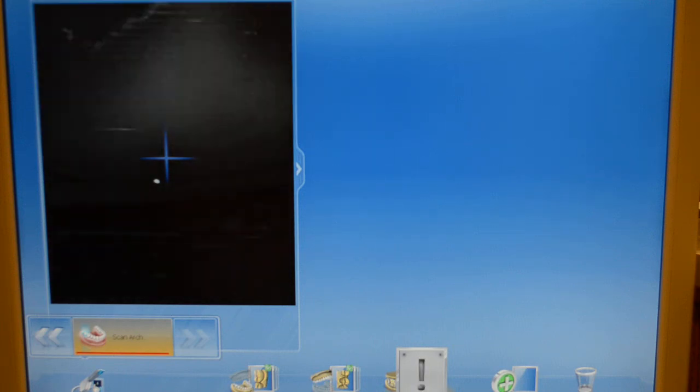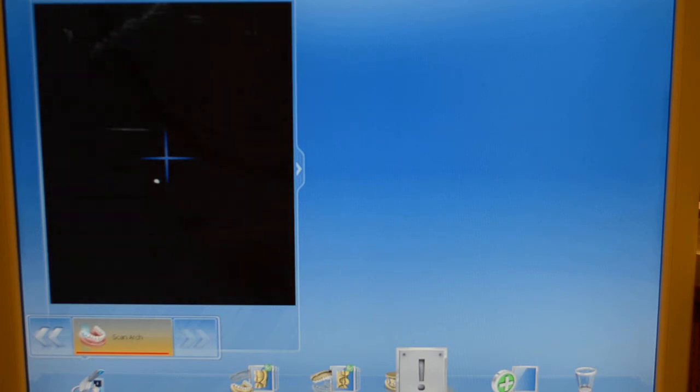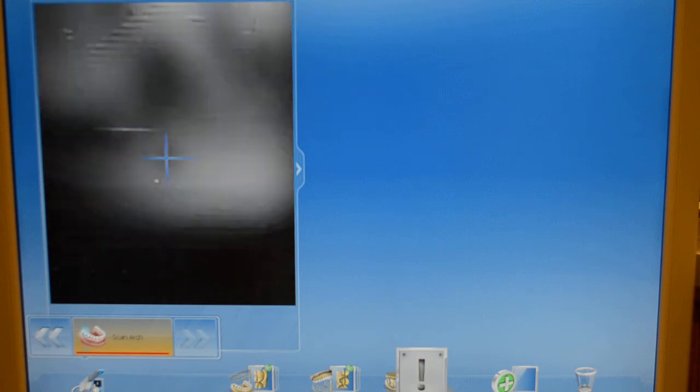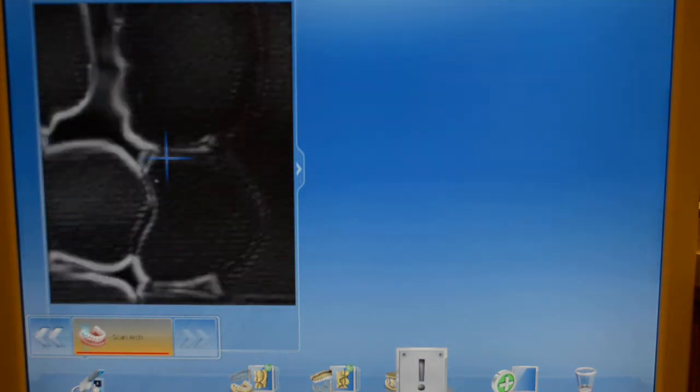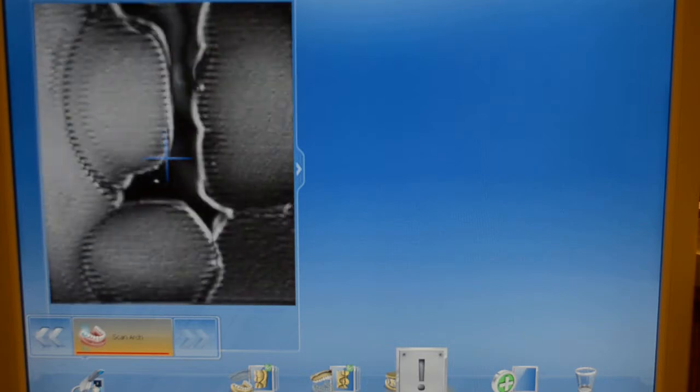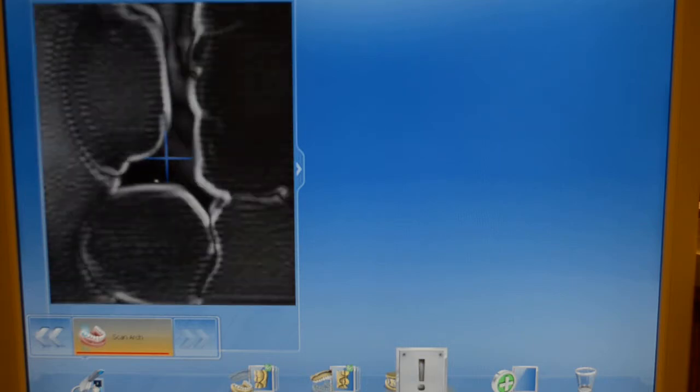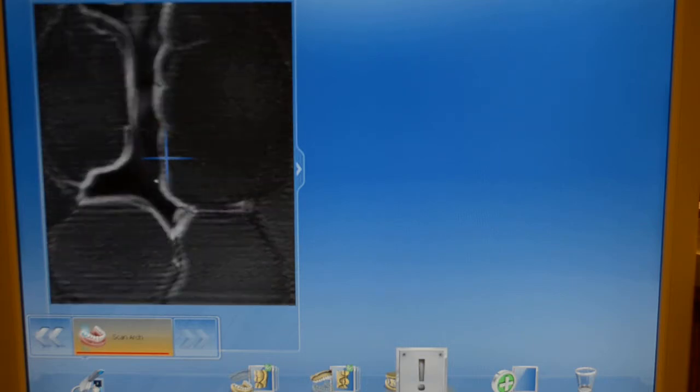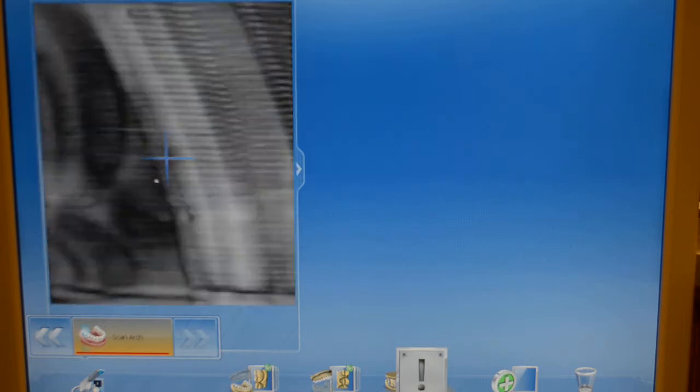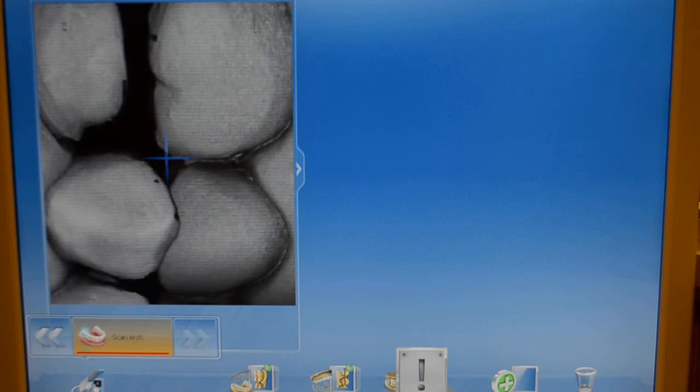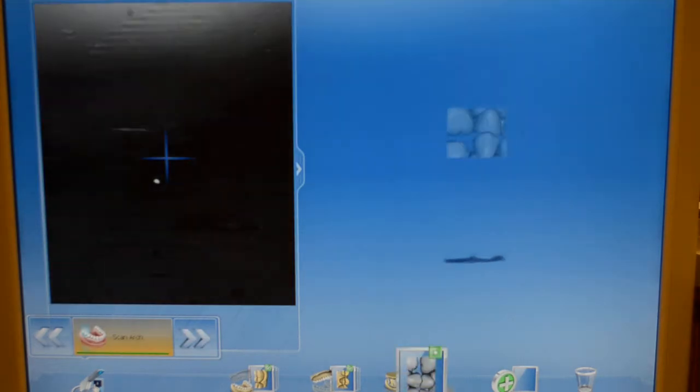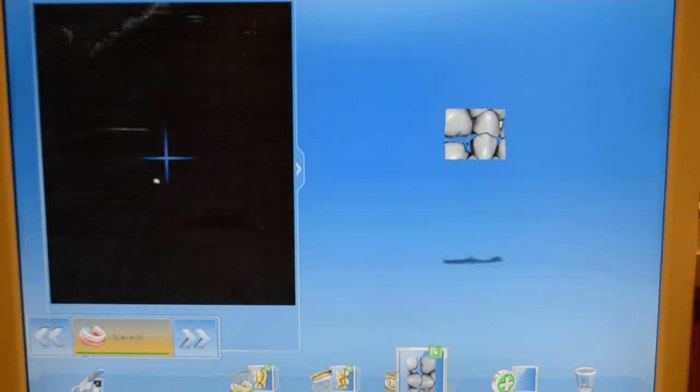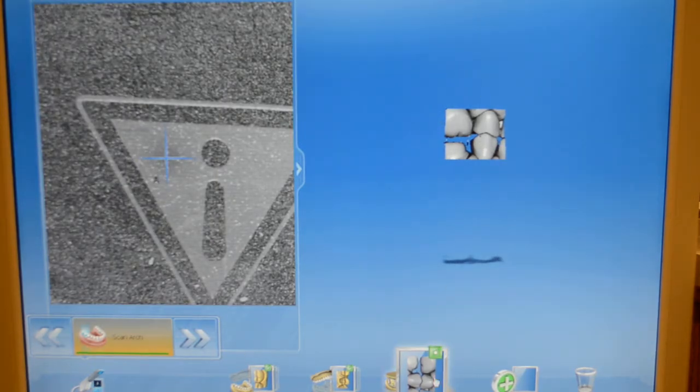Now, think of buckle bite as you're taking a great bite wing. And I know we're going to review this in other segments, but I'm going to break it down real simple just for this one because as easy as it is, it's an important image to take. So what you want to do is look at that screen and you want to line up just like a bite wing where you're getting 50% of your image is in the maxillary and 50% is the mandible. And I'm going to take one really nice bite wing picture.